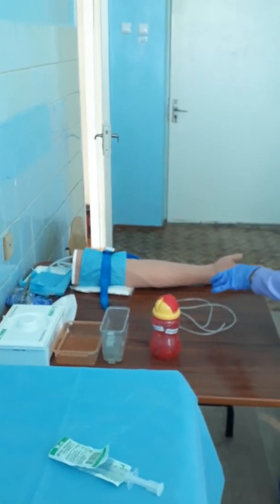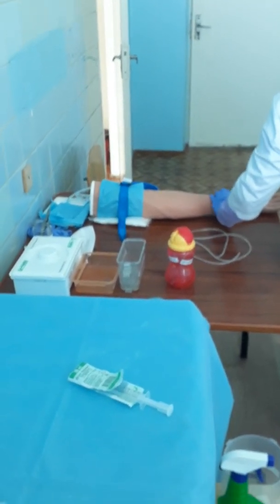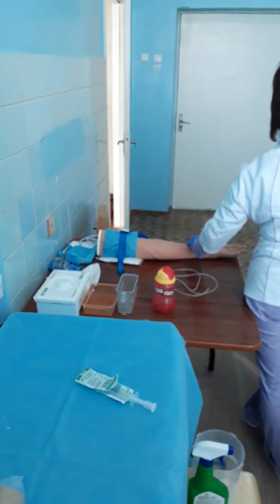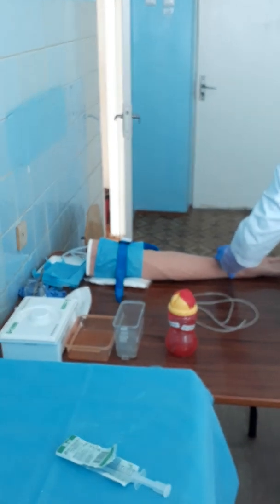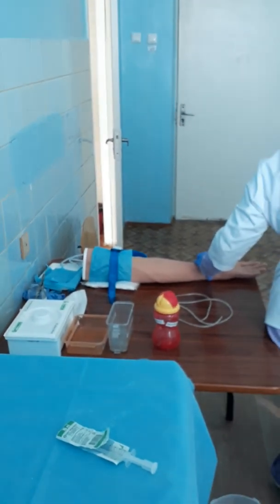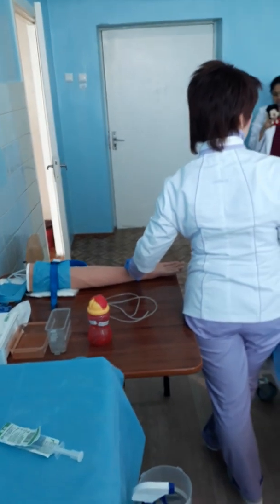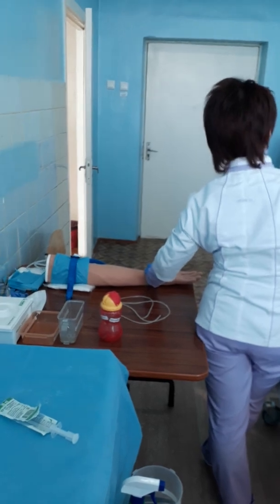And if you don't know whether it's right or not, you can check the pulse on the wrist. If you do it neatly, the pulse will remain. Now the pulse must be present, yes, it's right. Okay, we understand.